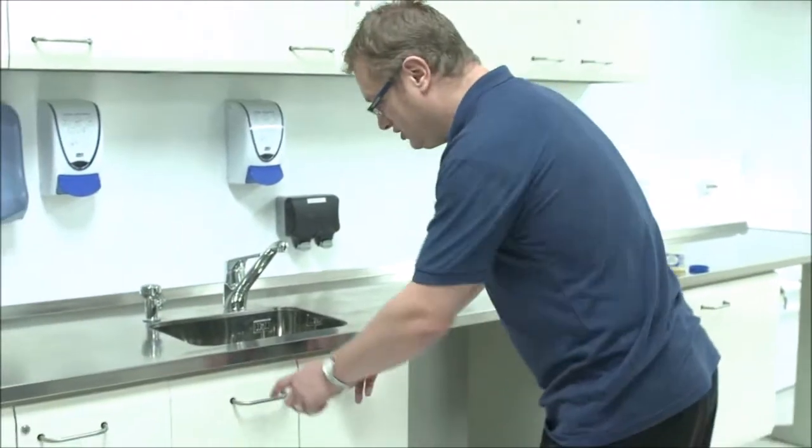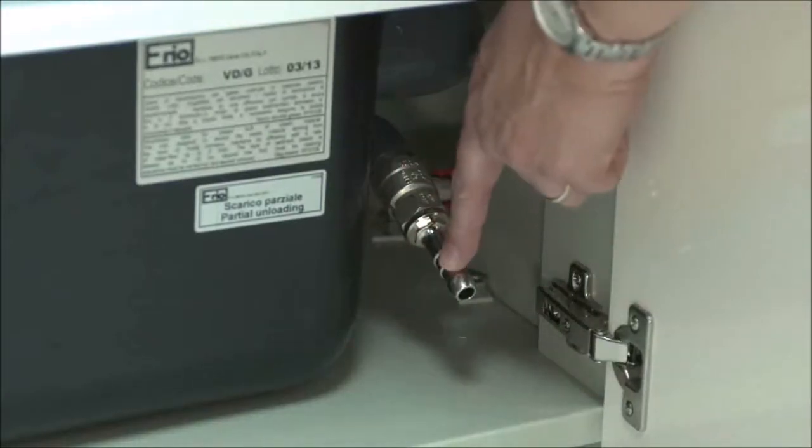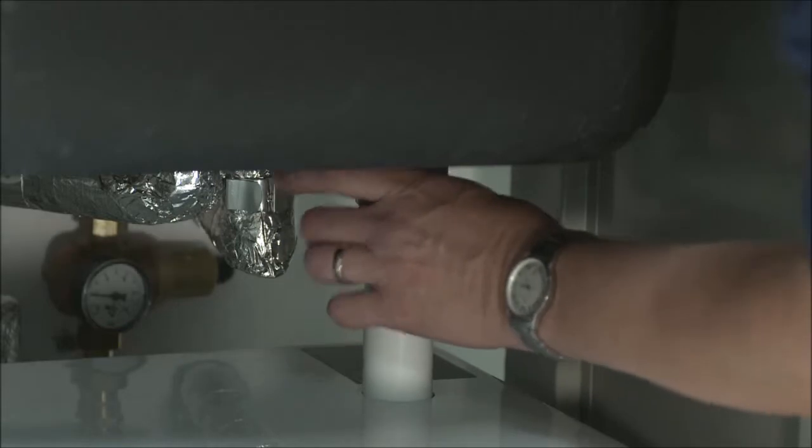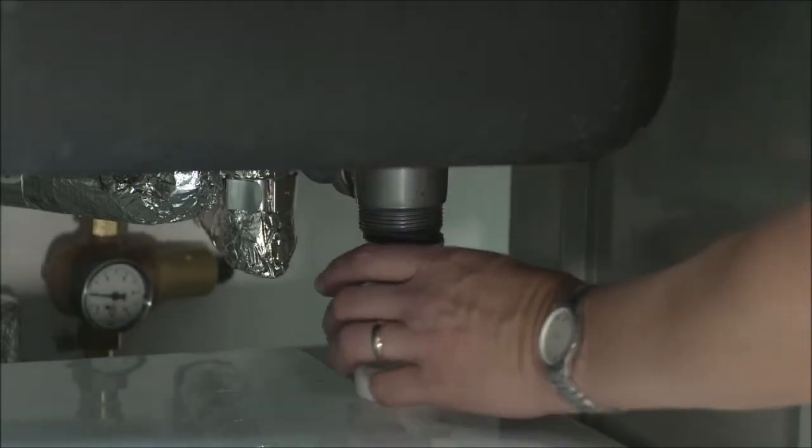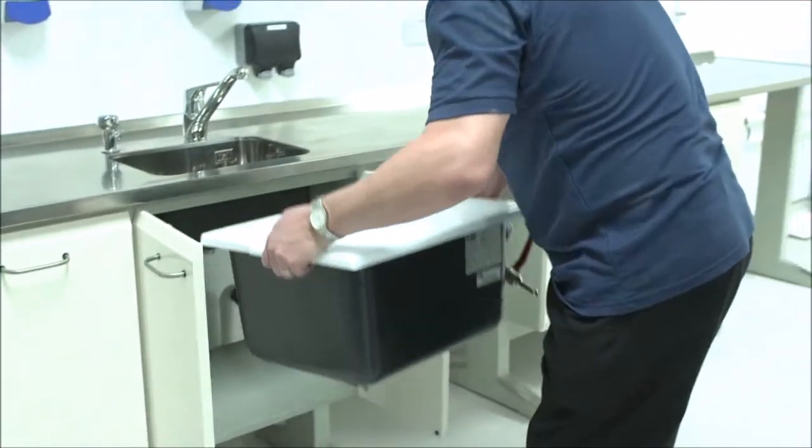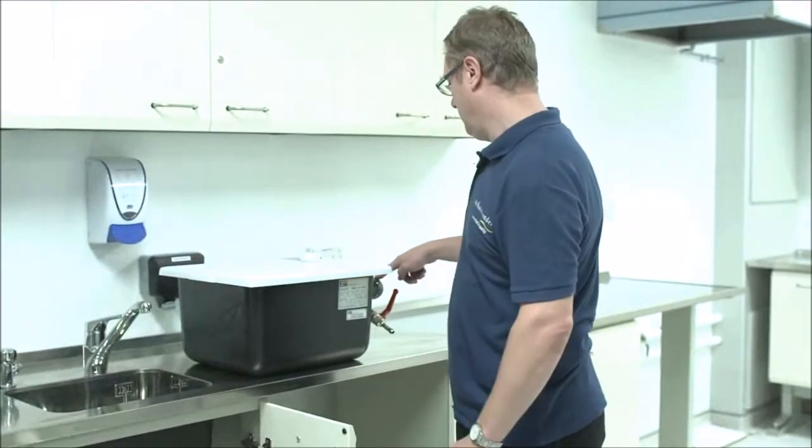To remove the decantation unit, first drain the water using the valve here. Remove the connection here and here. Lift out the decantation unit bearing in mind it will be quite heavy as it's full of plaster and water. Do not carry using the elbow attachment.